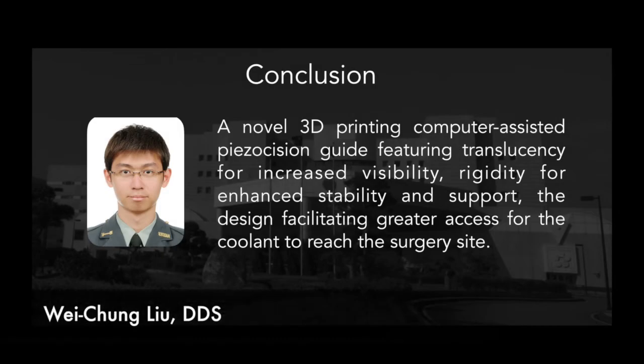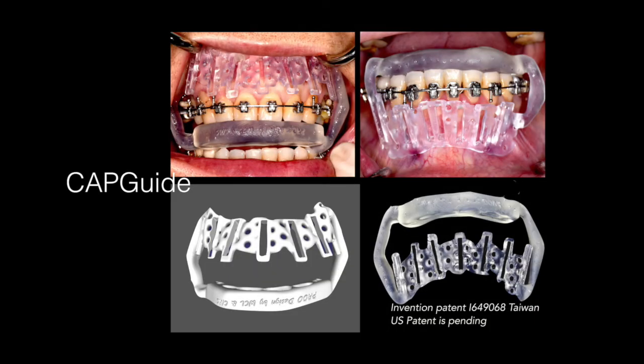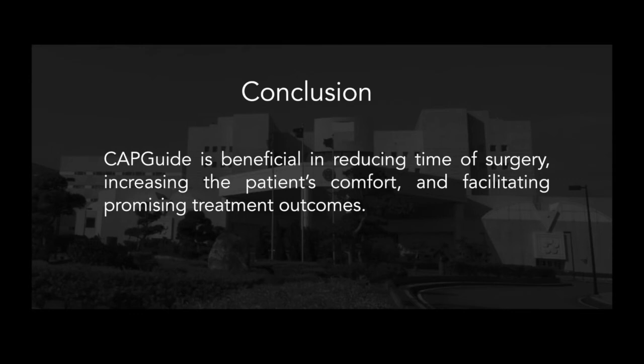To our knowledge, this is the first case report to use a novel 3D printing computer-assisted piezocision guide featuring translucency for increased visibility, rigidity for enhanced stability and support, and a design facilitating greater access for the coolant to reach the surgical site. This innovative design of CAPG is beneficial in reducing time of surgery, increasing the patient's comfort, and facilitating promised treatment outcomes. However, further randomized clinical investigations should be performed to evaluate the reproducibility, accuracy, and efficacy of this novel CAPG.